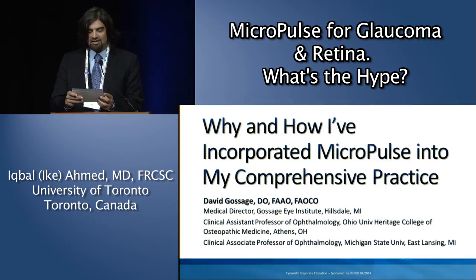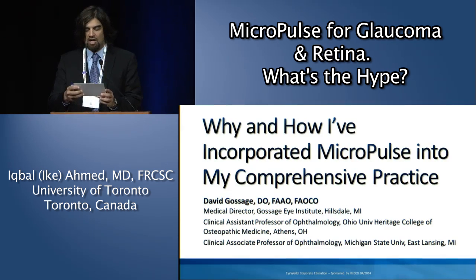Is there definitive data to support MLT is more effective than ALT for primary treatment for IOP reduction? We don't have any data to support this. We don't have any randomized studies comparing the effectiveness. I can tell you anecdotally, I certainly believe it is. And the response rates, we'll have to see, of course, in terms of looking at some of that data.